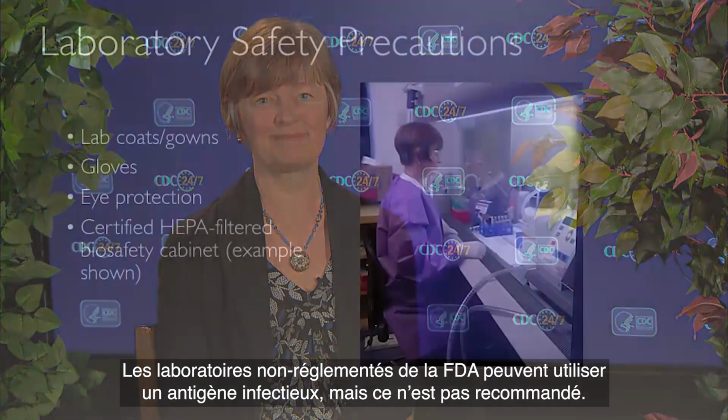The most common specimen types used in IgM ELISA are serum and cerebrospinal fluid, and there is potential for these specimens to contain live virus or other unrelated etiologic agents. The reagents used in the CDC IgM ELISA are all non-infectious. Non-FDA regulated laboratories may use infectious antigen, although this is not recommended.